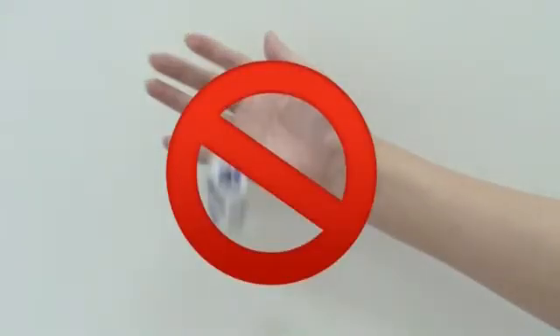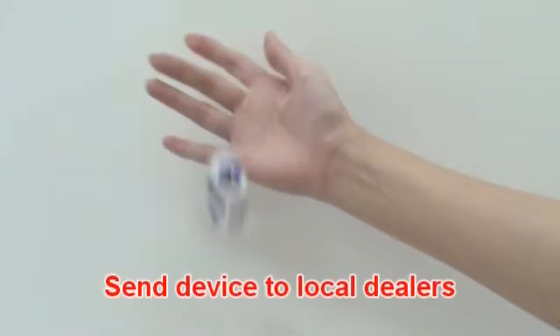Please check if the device is damaged if it falls. If you cannot determine this, please send the device to your local dealer for service.